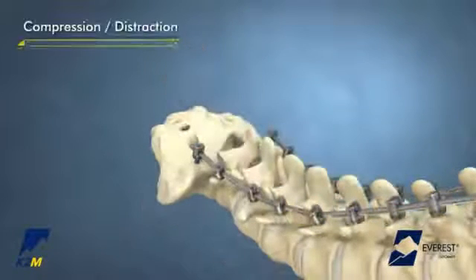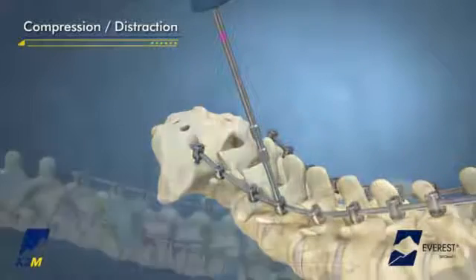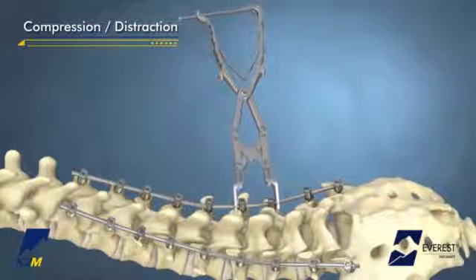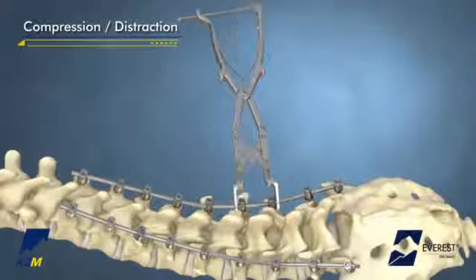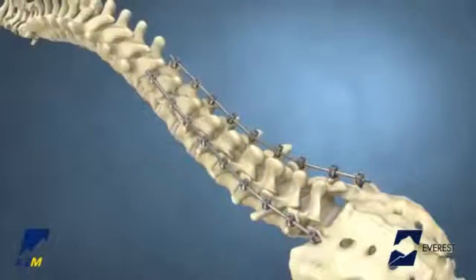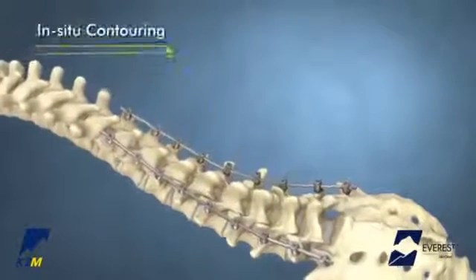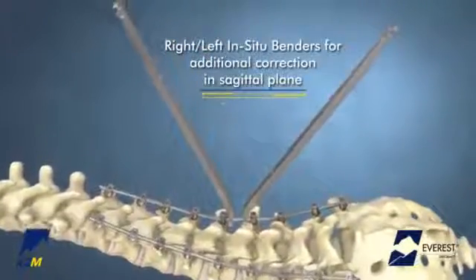Compression and distraction may be performed with the Everest implants while the Set Screws are provisionally tightened and loosened. Begin proximal to the apex and compress or distract by releasing the Set Screw one or two turns. Once the desired amount of compression and distraction has been achieved, provisionally tighten the Everest Set Screw to hold the implant in position. Once the rod has been placed and provisionally tightened, the rods may be contoured in situ. To achieve additional correction in the sagittal plane, use the right and left in situ benders.